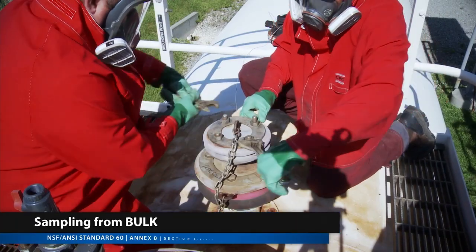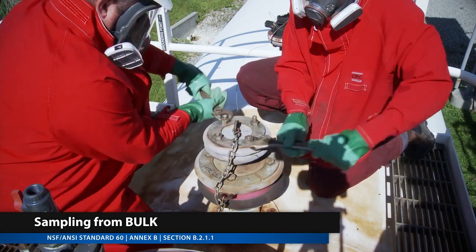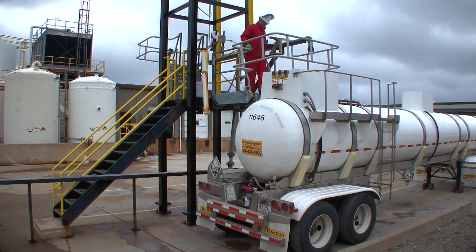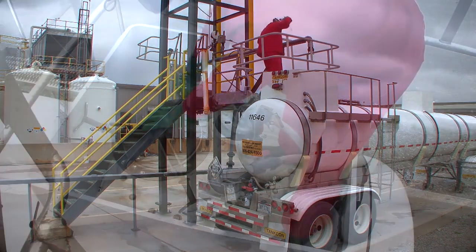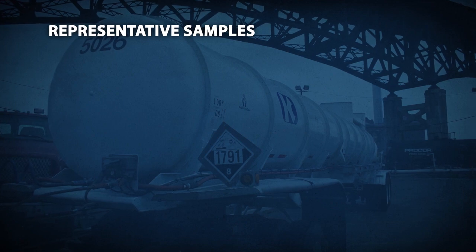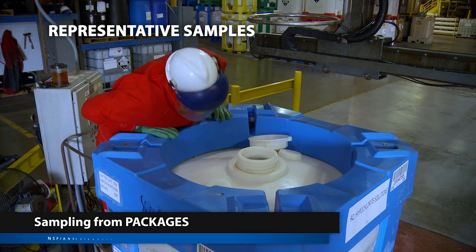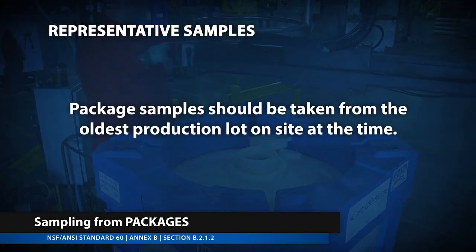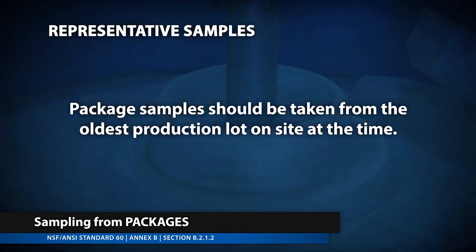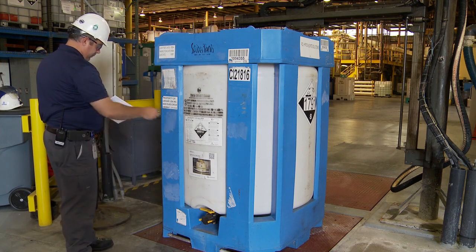If sampling from bulk, a specified quantity of sample should be obtained from a bulk storage tank or bulk shipping vessel through normal connections. Sampling from bulk shipping vessels is preferred if available on site, as it's representative of the final container of product being shipped to the customer. Samples should be taken from the oldest production lot that's on site at the time. If sampling from packages, the specified quantity of sample should be collected from packaged inventory to fulfill the requirements of the NSF ANSI 60 Standard. Samples should be taken from the oldest production lot that's on site at the time.